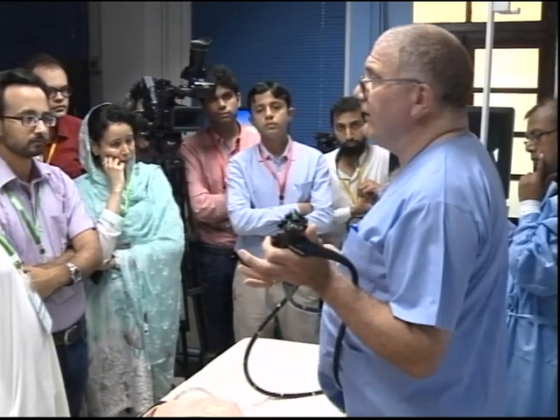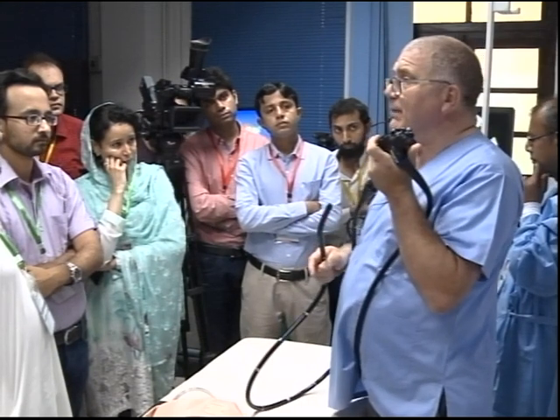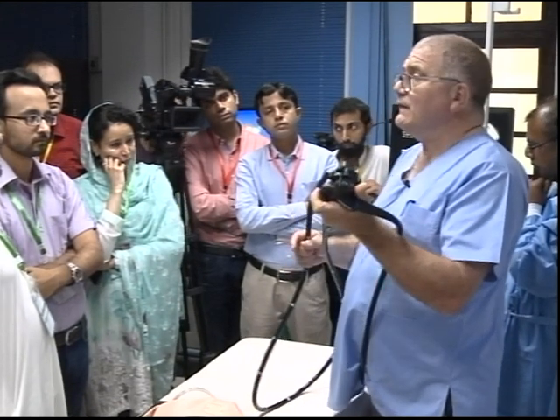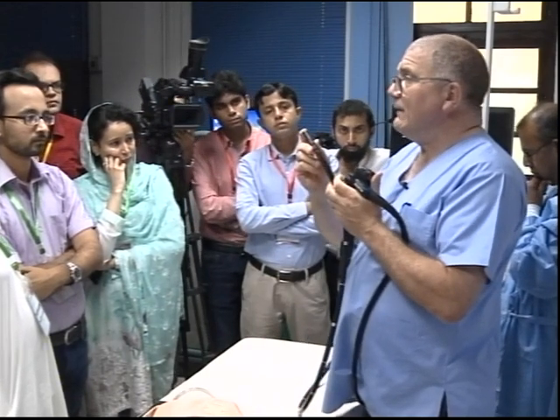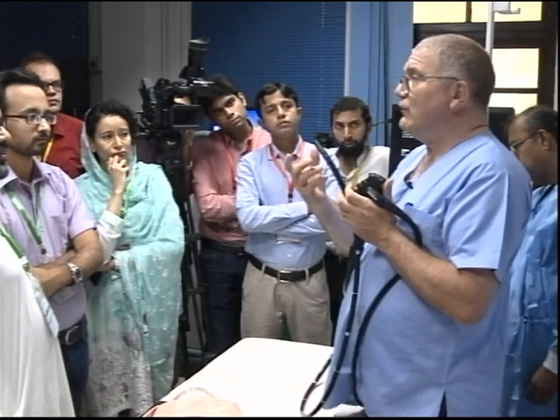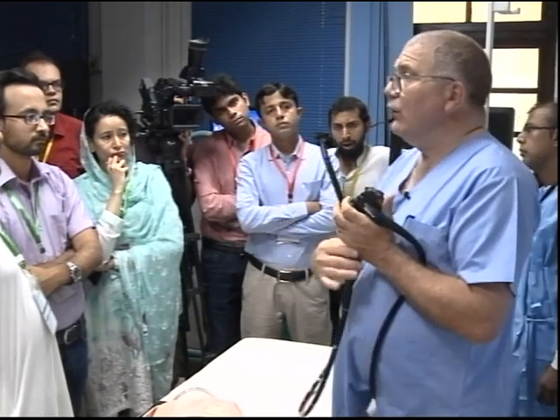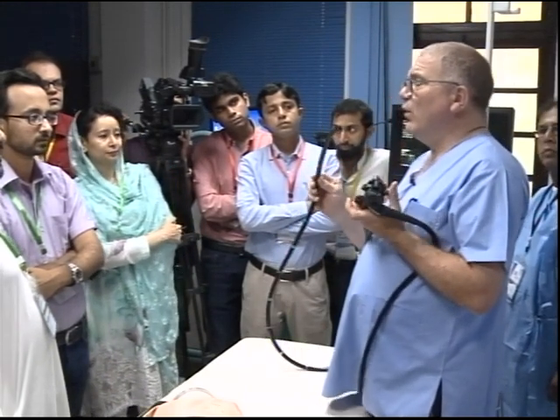You put your finger over this, it actually stops the air. The hissing that you see is air escaping. You actually cover that, it stops the air escaping and it pushes it down the air water channel. Water's dripping out of the end here, so it's actually pushing water out of the tip of the scope down the air water channel, so it's not blocked. So what's the problem? Cover this, air will come out. So what's the problem?